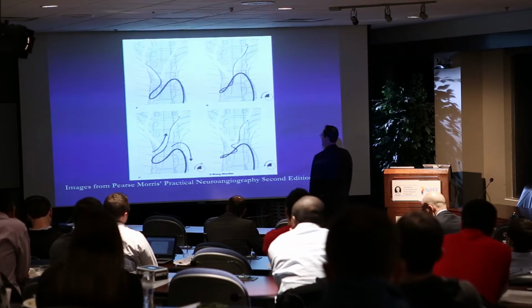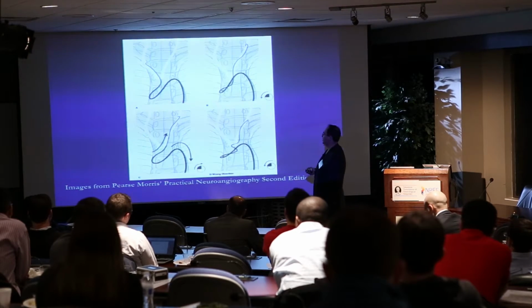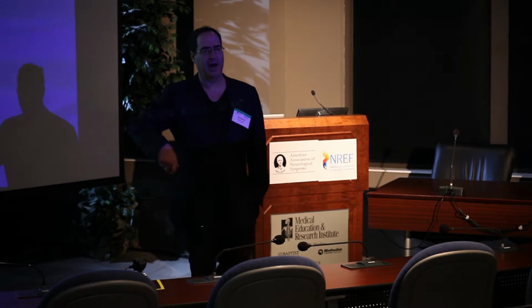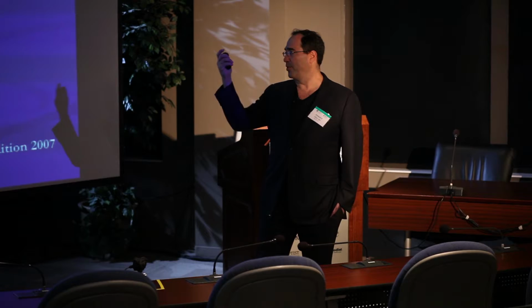Forming the Simmons, once you learn how to do it, usually becomes very straightforward. The cardiologists actually form it against the valve. They go all the way around the arch, then bump the catheter up against the valve, flip it, and pull back.